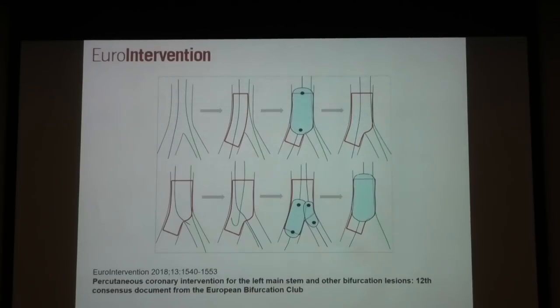Then wiring, if you want to use T stenting, you wire distal struts. If you want to use Culotte, you can do the proximal struts. فهي لما انك تسوي بعديها بصير kissing balloon, simultaneous kissing balloon, and then followed by POT. These are the summary of single stent strategy in left main.